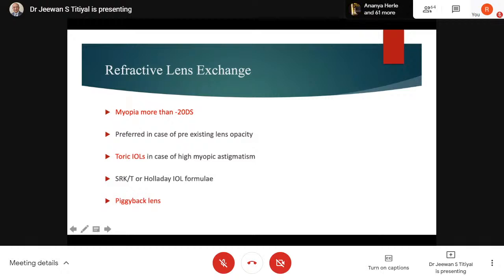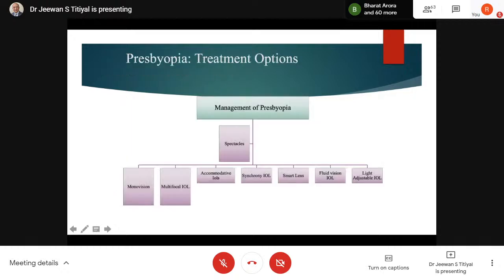Refractive lens exchange is normally for those patients who are around 40 plus, and they have a little bit of lenticular changes also. And we can give a nice presbyopic lenses also. But cases which are hyperopic, sometimes more than +6, +8, and AC depth is also less to accommodate phakic IOLs and not suited for lasers can also be considered for refractive lens exchange in these cases.